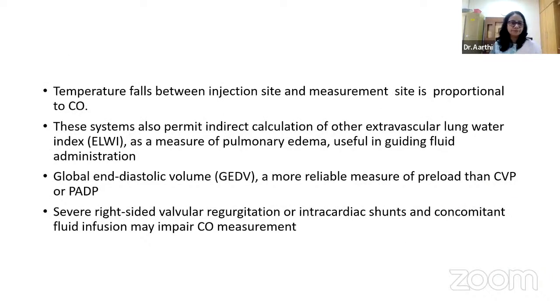So all these thermodilution techniques also provide us with various other parameters to assess the hemodynamic status of the patient. So temperature falls between the injection site and the measured site proportional to the cardiac output. These systems also permit indirect calculation of what is called the extravascular lung water index as a measure of pulmonary edema, which is helpful in guiding the fluid administration.